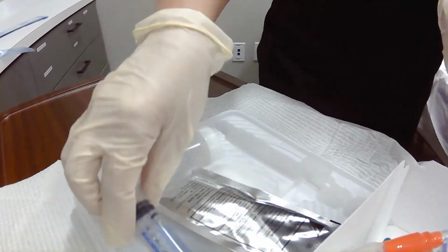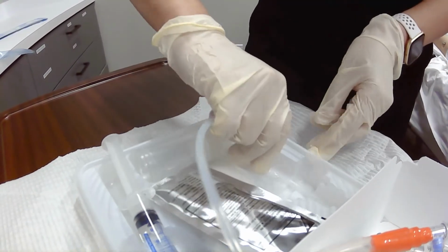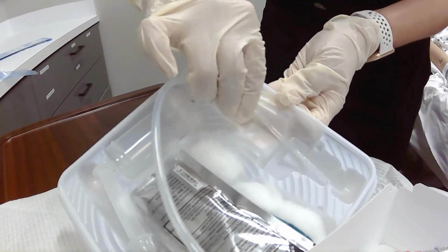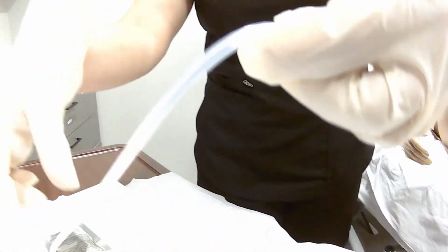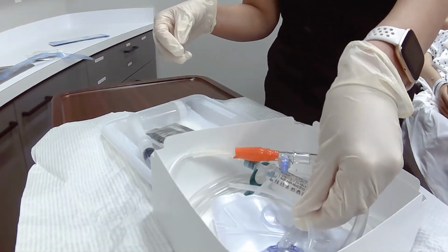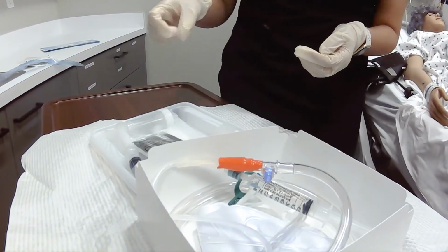And I am going to set that aside there. And I'm going to lubricate that catheter tip very generously because I want to make sure that it slides in gently into the urethra. And then I'm going to set this to the side and back into the box, okay?